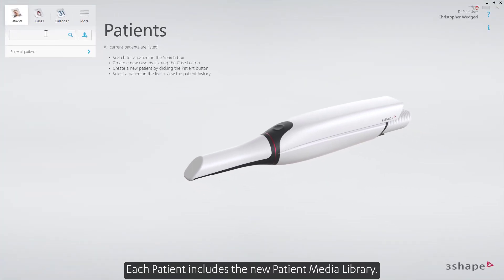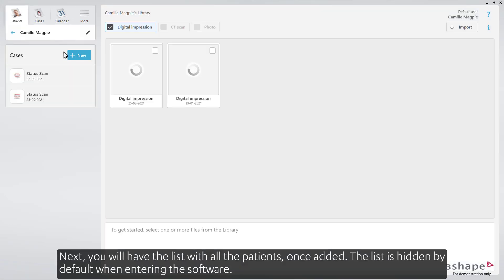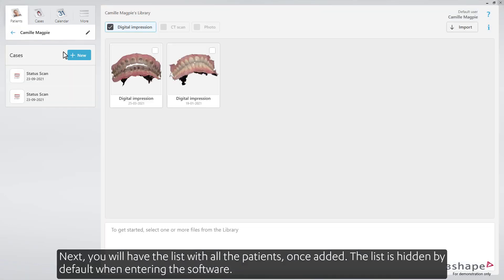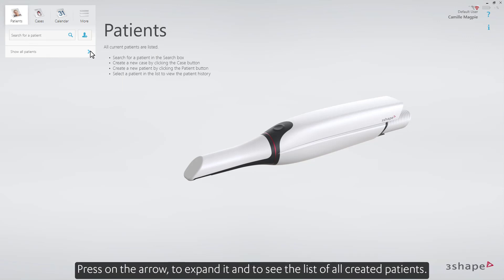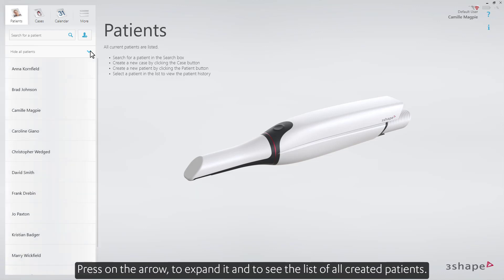Each patient includes the new patient media library. Next you'll have the list with all the patients once added. The list is hidden by default when entering the software. Press on the arrow to expand it and to see the list of all created patients.